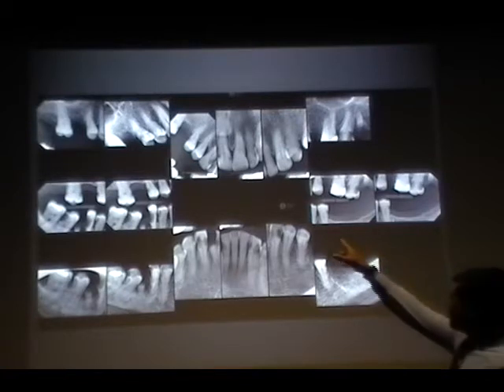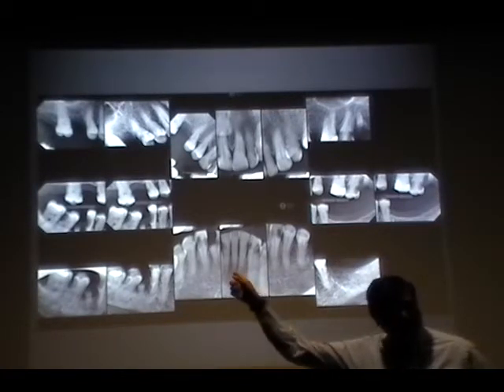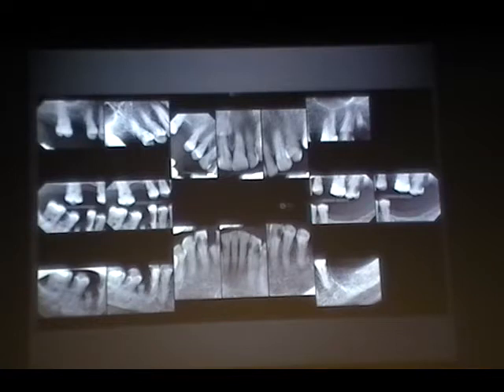Okay, next. So the occlusals. Your name, please. Oh, Bethany. The occlusals are not parallel. Okay. Like it's on an angle. Also, some of the occlusals are cut off, and the second molar is largely cut off, and you're missing... Wait. I'm lost now. We're looking at the second image, right? Yeah. Okay, go ahead. And then you cut off part of the canine as well. Okay.